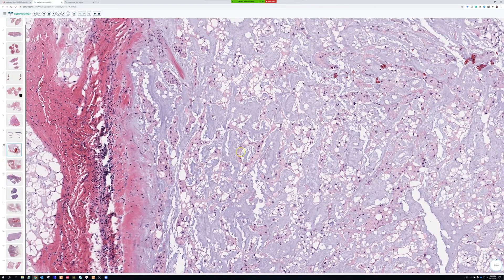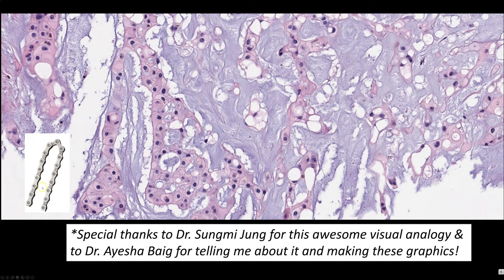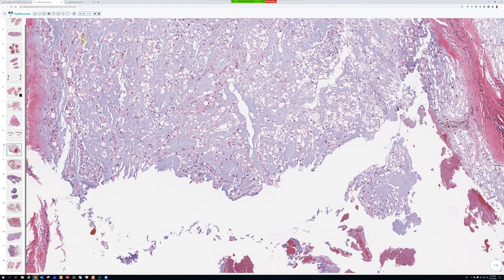The bicycle chain analogy for chordoma cords is really cool — it kind of loops around. I want to give a shout-out: while explaining the chains and cords of chordoma to McGill residents, I learned from Dr. Aisha Baig that their soft tissue mentor Dr. Sungmi Jung likens the curving cord shape of chordoma cells to a bicycle chain. You can see these bulging expansions along the cord that wrap around just like a bicycle chain. Thanks to Dr. Jung and Dr. Baig for sharing this visual tip and for compiling these beautiful photographs.